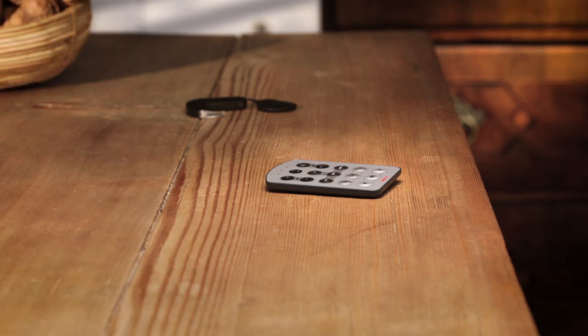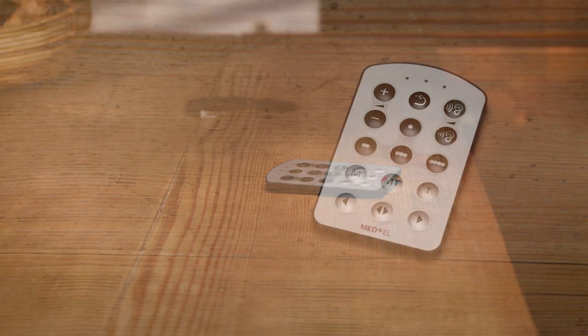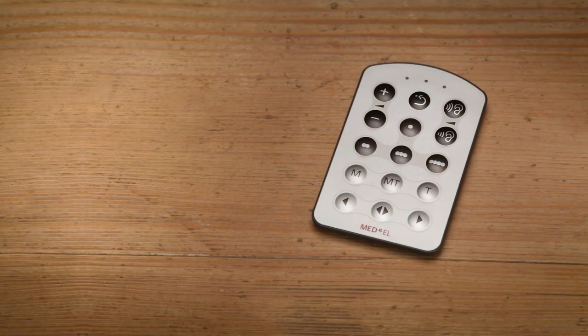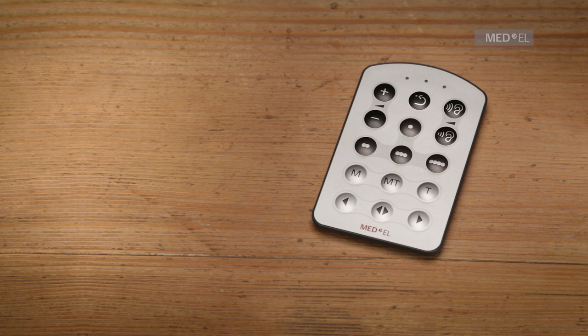Your audio processor only has an on-off switch. All other functions can be controlled with the fine-tuner remote.